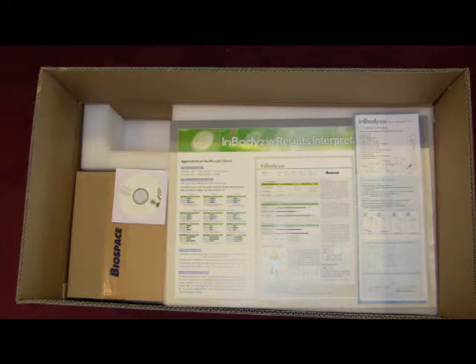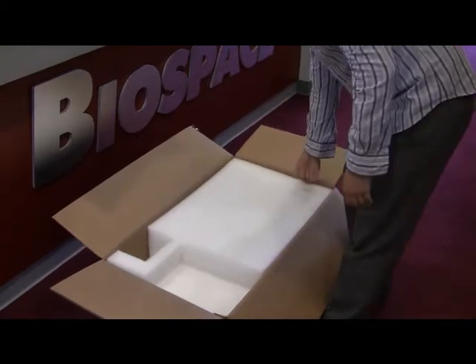When you open the box, you will find the installation guide, user manual, poster, and results sheets. After removing these items, remove the top pad.